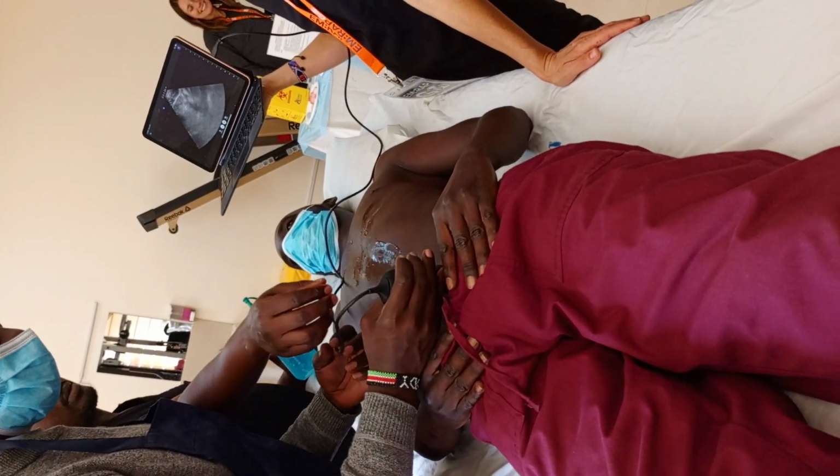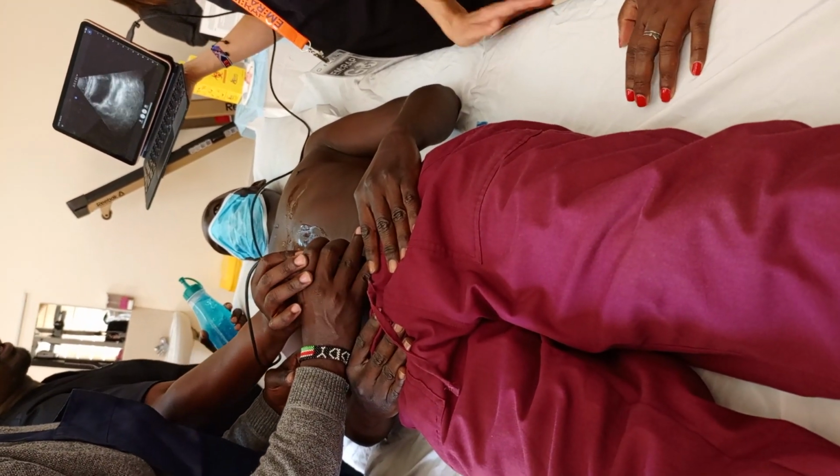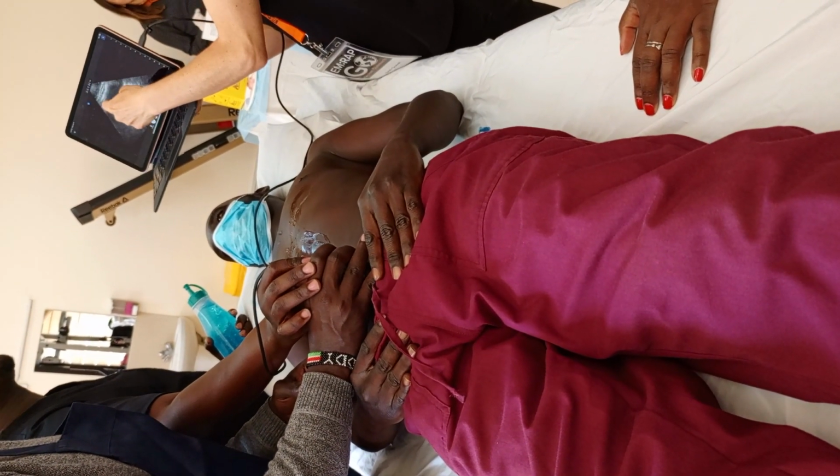You do LMAs as well. Well, let's see how the Pro is. The Pro is a Pro. Oh my gosh, there's black. That means there's fluid, but what is that?